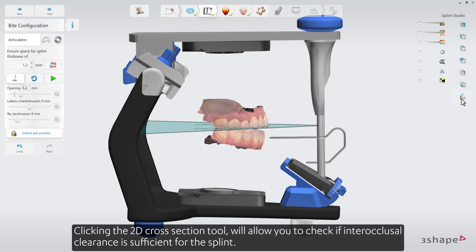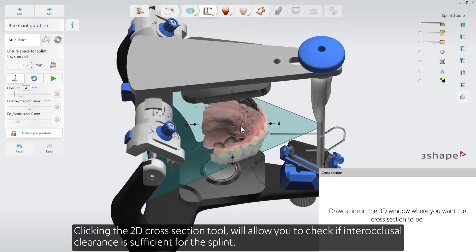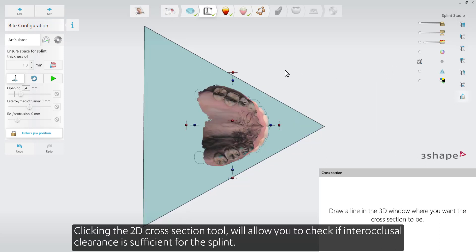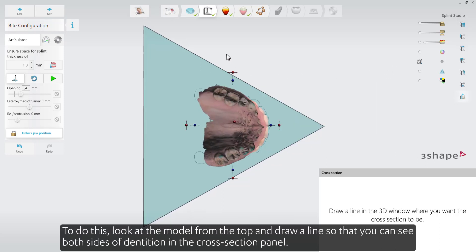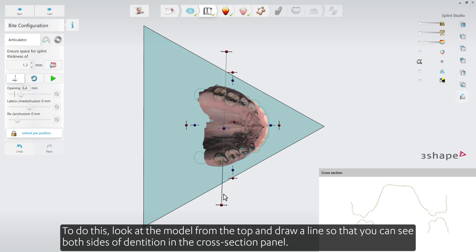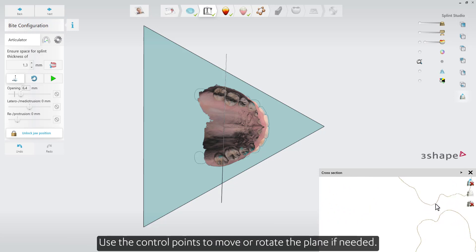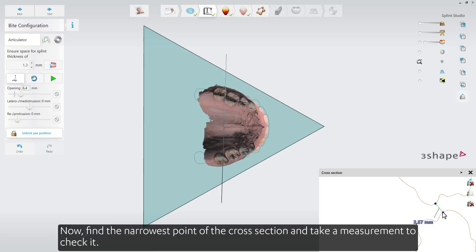Clicking the 2D Cross Section tool will allow you to check if interocclusal clearance is sufficient for the splint. To do this, look at the model from the top and draw a line so that you can see both sides of the dentition in the Cross Section panel. Use the control points to move or rotate the plane if needed. Then find the narrowest point of the cross section and take a measurement to check it.